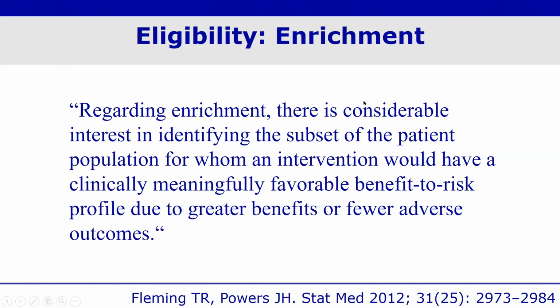Now, moving on to a second point that has briefly been touched upon before regarding clinical parameters, I will talk a little bit about enrichment strategies using imaging. I will refer here to a citation by Dr. Fleming, who will talk later in this session. He stated in a paper a few years back that regarding enrichment, there's considerable interest in identifying the subset of the patient population for whom an intervention would have a clinically meaningfully favorable benefit to risk profile due to greater benefits or fewer adverse outcomes.